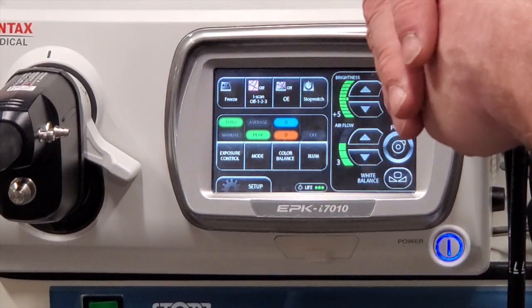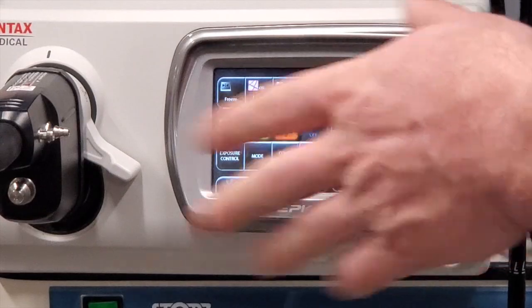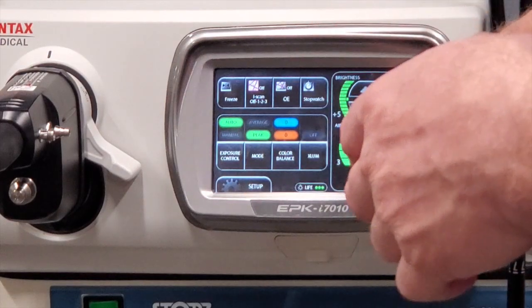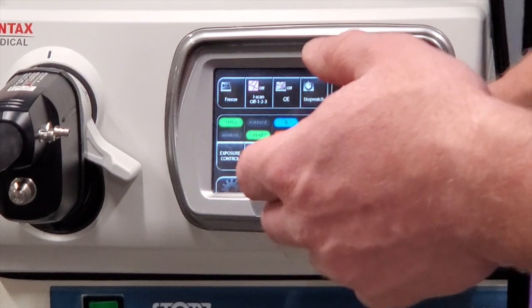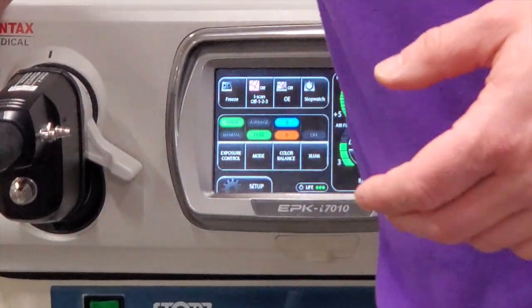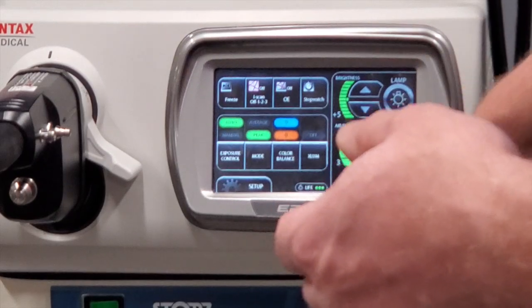No further ado — what we'll do is test the first scope. We'll turn the pump on; you'll hear it. Alright, it's quiet. It is pushing air out here. We'll check the pump off.